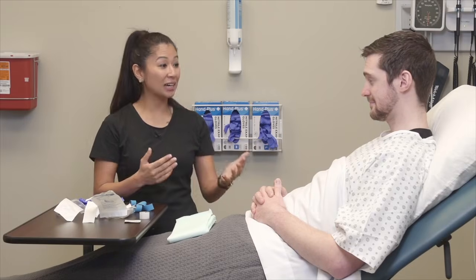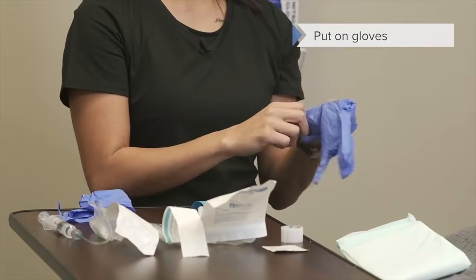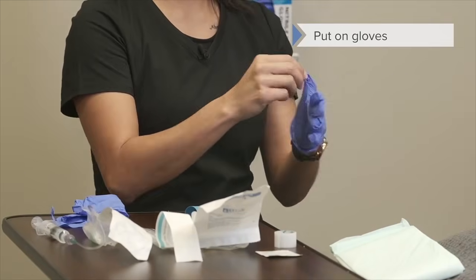So now that we've gotten our equipment ready, now let's talk about the actual IV insertion. So because I'm going to make contact with my patient, I'm going to first put on gloves. And when I'm using my gloves, I can use standard just clean gloves for this procedure.